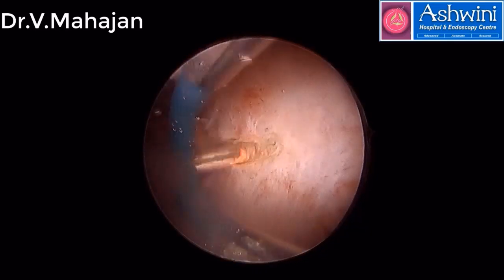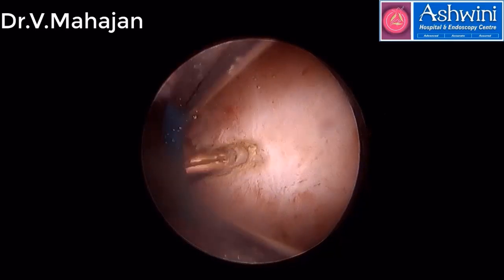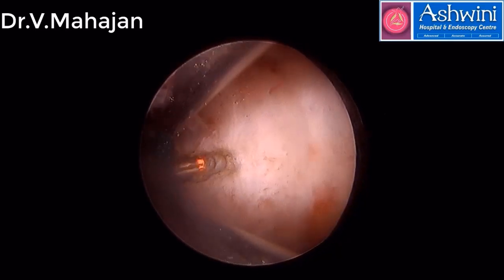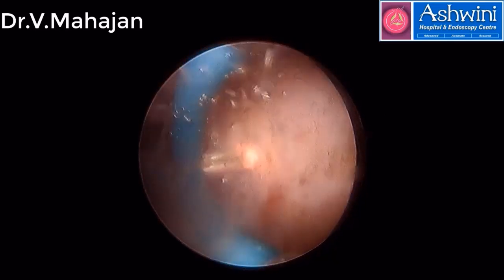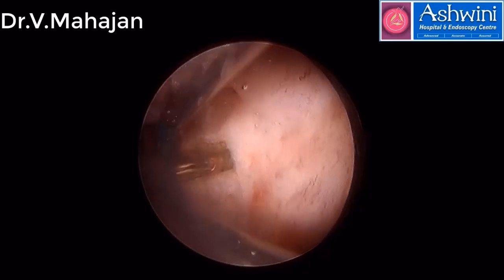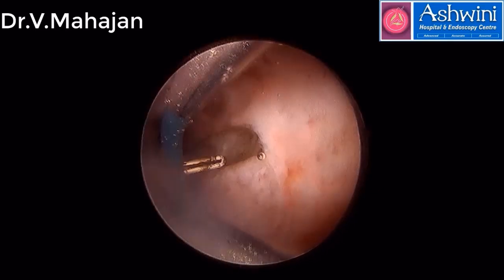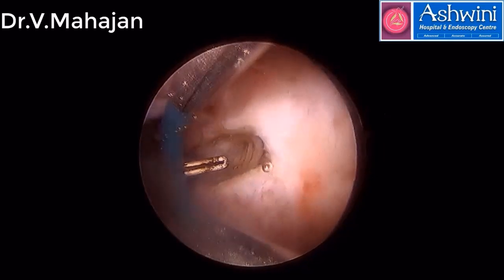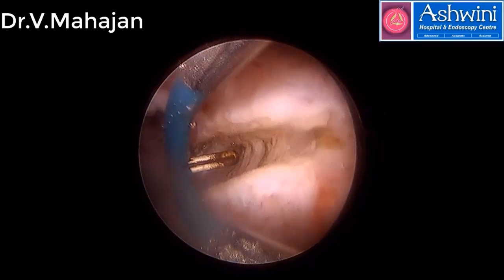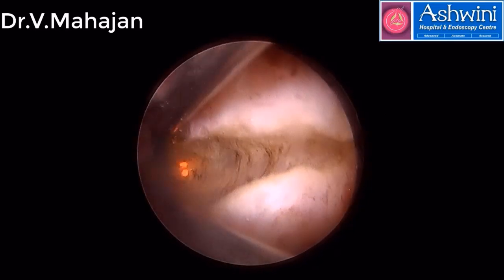The Foley's is kept in place, so when we open the cavity, the intervening wall is cut, and when we enter the contralateral cavity, we should be able to diagnose that we have entered the cavity. That diagnosis is done by the presence of the Foley's. Also, the Foley's prevents the fluid from coming out from the other cervical canal, and the distension is maintained.